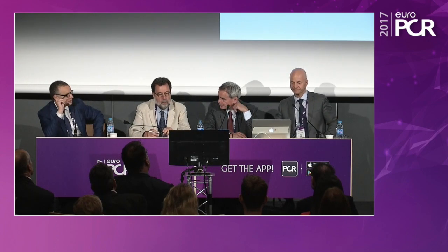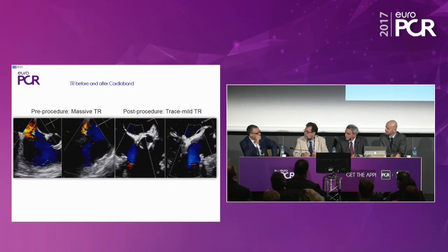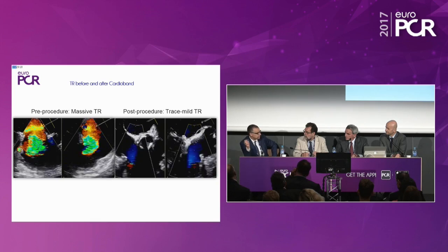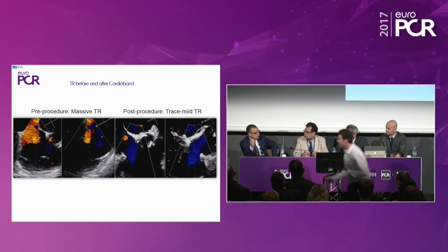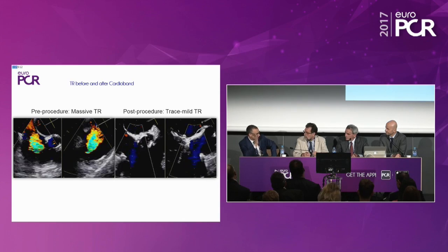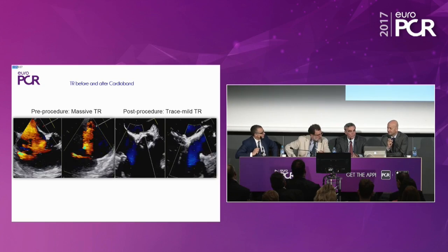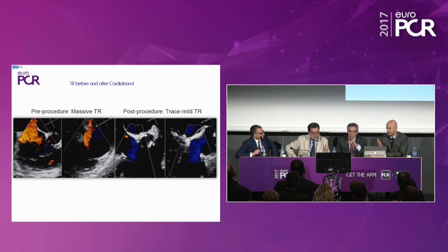Oh, you want to do it from here? So I think it is a very important point that if we want to improve our outcomes, we need to fix the cardioband like we do for the mitral on the 2 trigones. We need to do the same thing for the tricuspid. We have to reach the septum, so go beyond the coronary sinus. This is something we are learning now. But I think this is too much of a detail right now. I mean, we have to think about feasibility.